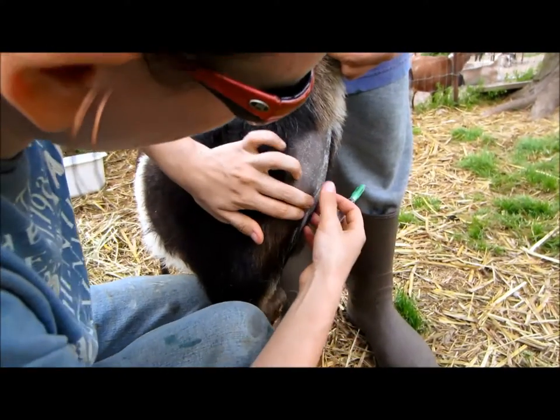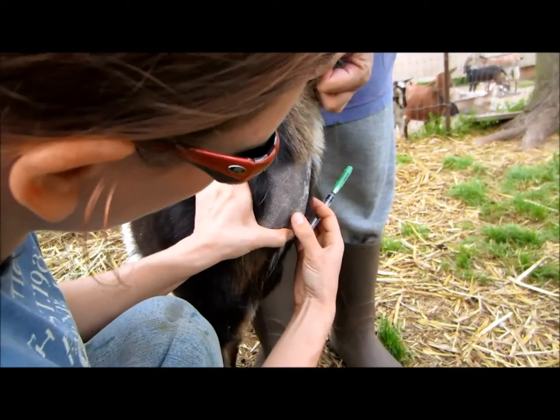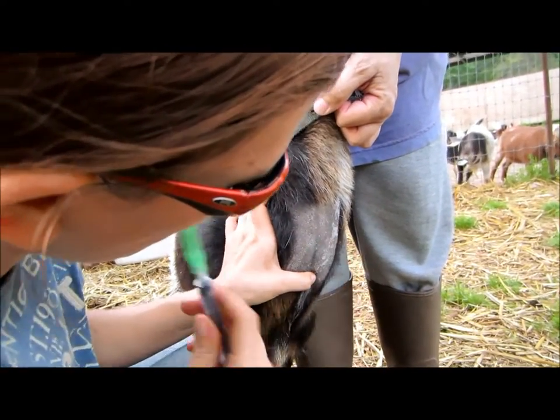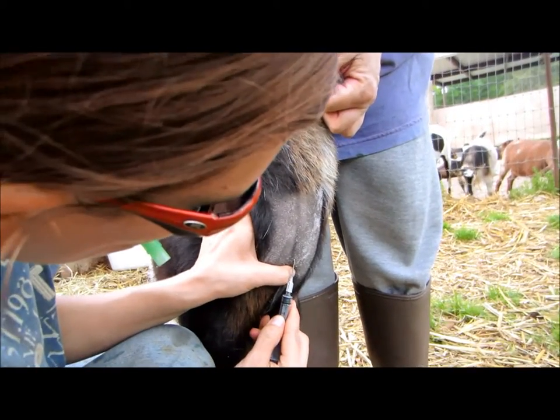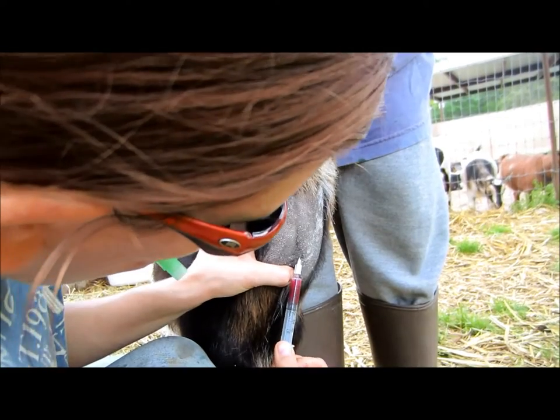Now we're going to do another. This is Miss Dulce. We've shaved her neck because she wasn't nice and naked like Miss Witt's Crack was. You can see her little vein popping up there. And the needle goes in, and out the blood comes.